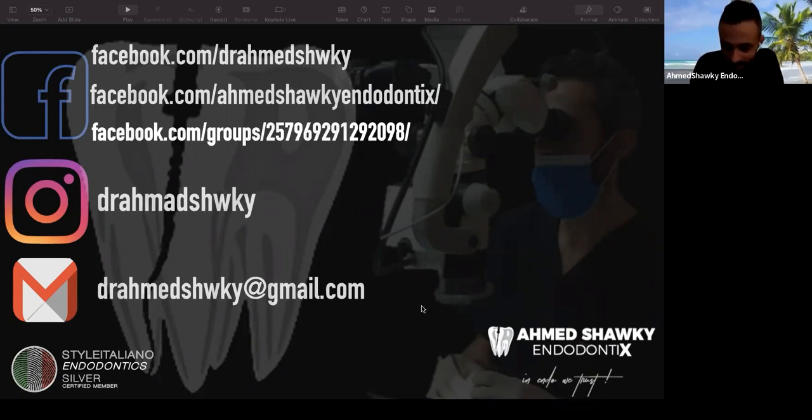What do I do if I lost patency halfway through? I assume I already got patency before. Okay, lost patency halfway through, this is transportation. This is not losing patency, this is deviation of the canal, because I can lose patency in the apical part due to a lot of reasons, and it's called losing patency. But losing patency halfway, that's definitely a transportation. As a quick review of how we manage that, we need to pre-flare more in order to be able to regain the path into the canal. Any more questions?